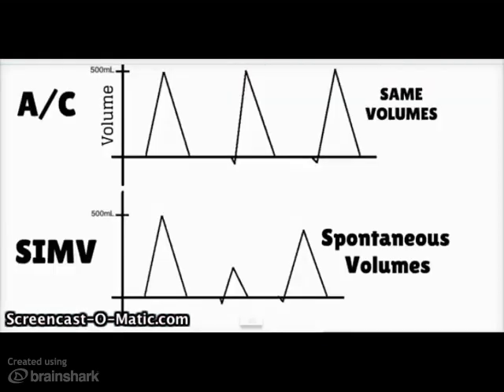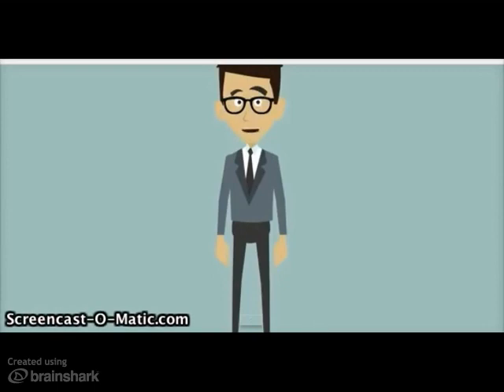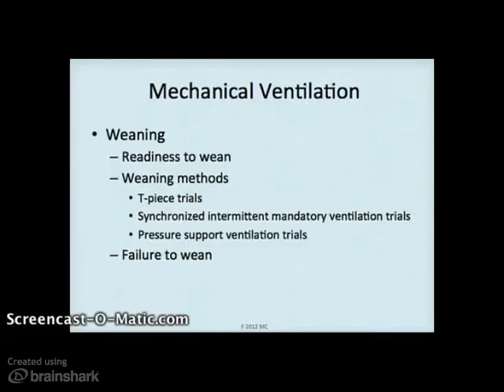So there you have it, AC and SIMV. There are other differences too, but this should be enough to help you get started. So that's a little review of the different ventilation modes, because you need to understand them when we start to talk about weaning the patient off the ventilator.